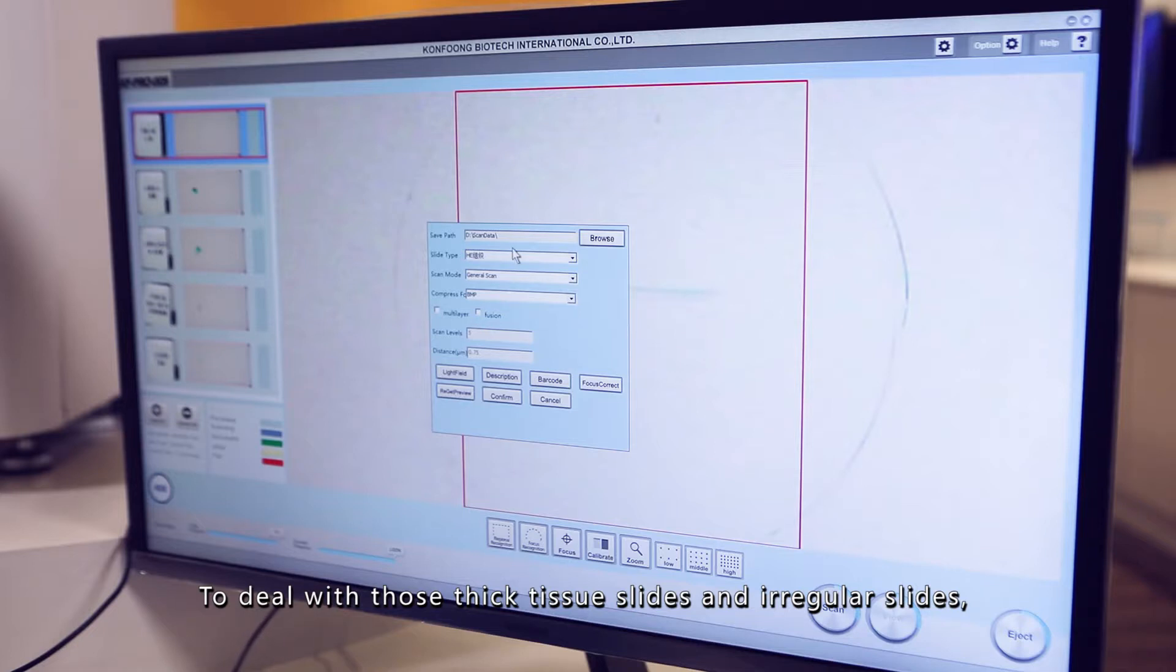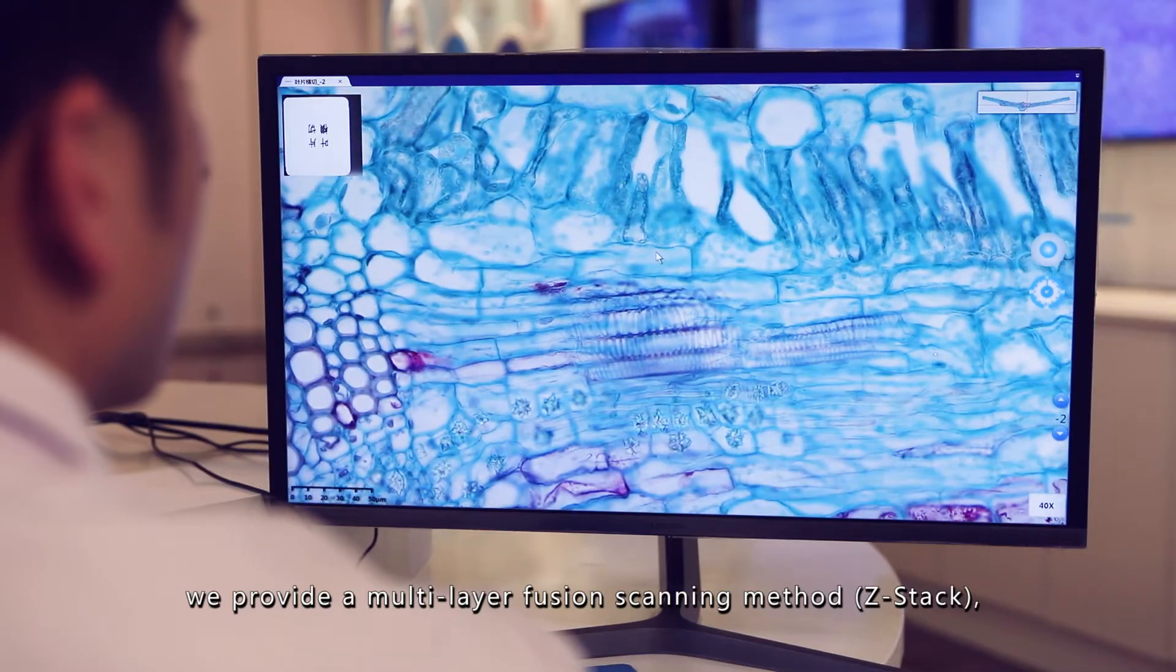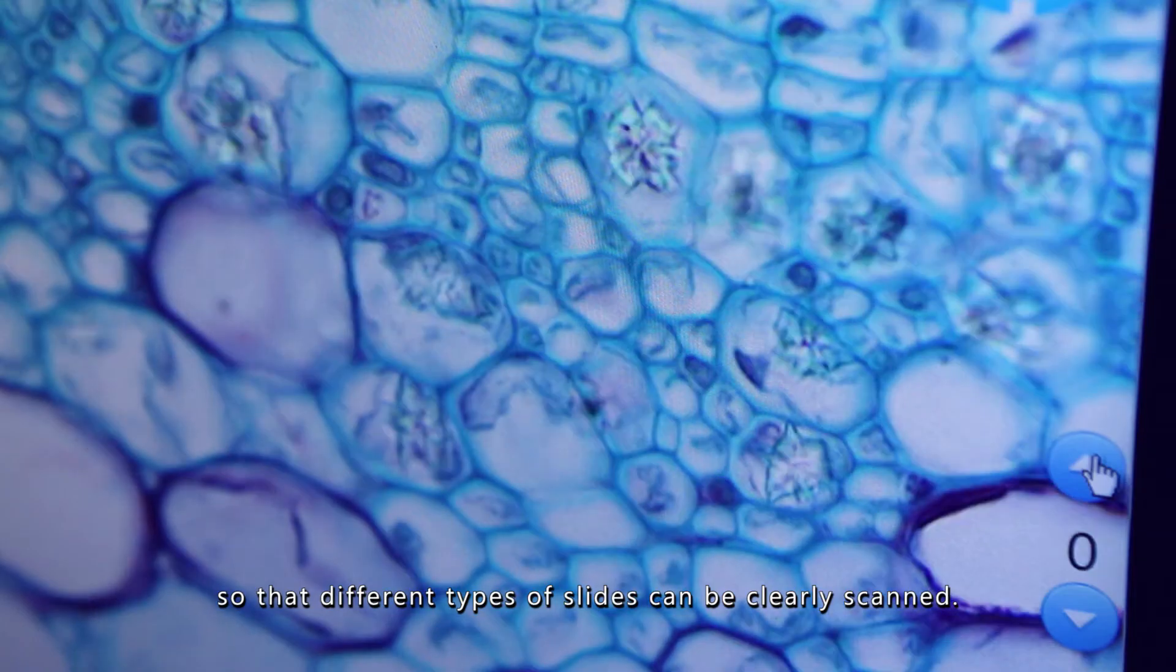To deal with thick tissue slides and irregular slides, we provide a multi-layer fusion scanning method, Z-Stack, so that different types of slides can be clearly scanned.